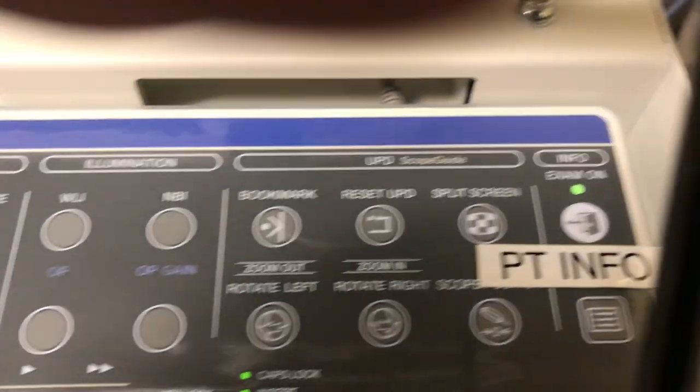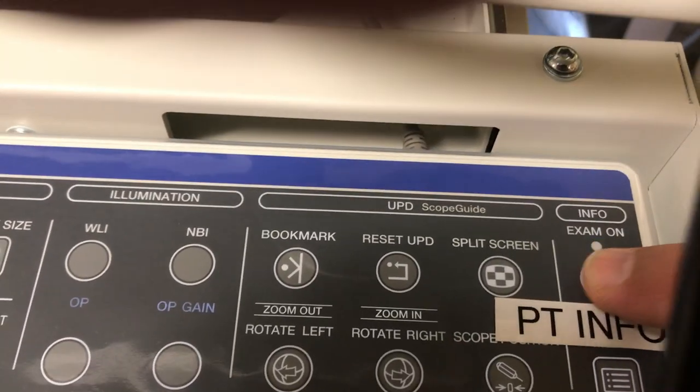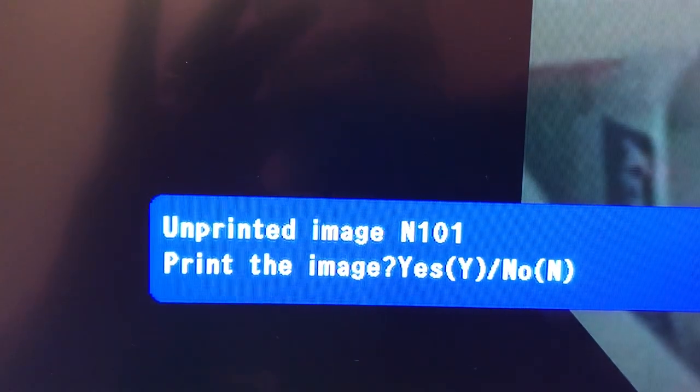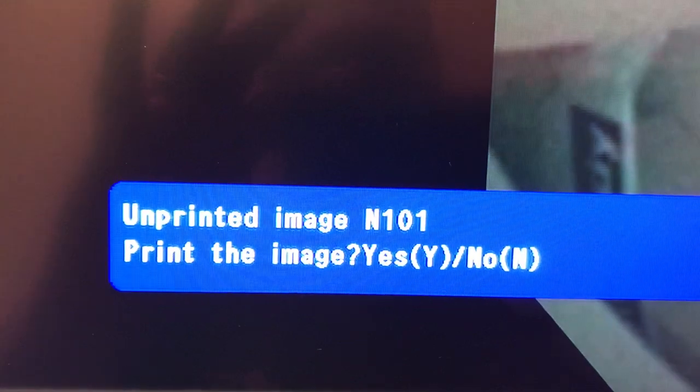So the rest of the exam goes on and we're at the end and we want to print the pictures. You're going to go to patient info. And then what you should see present on the screen is unprinted image — print the image — and you want to press Y for yes.